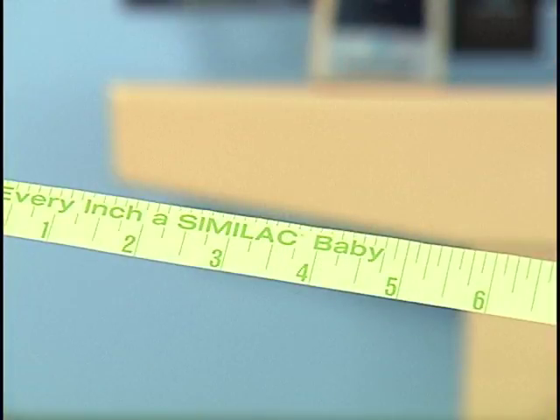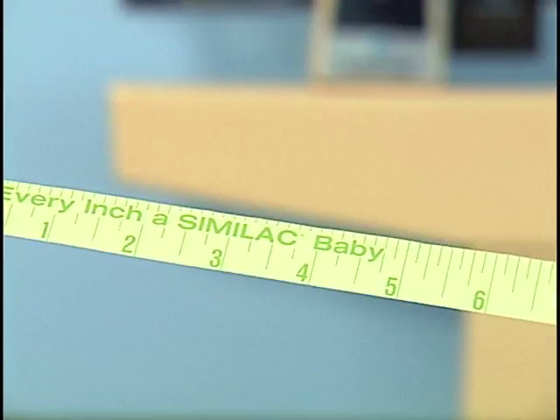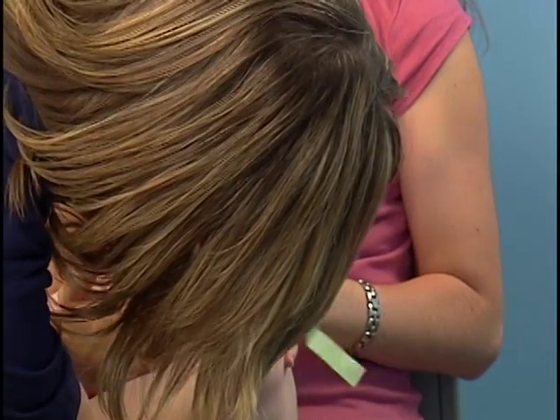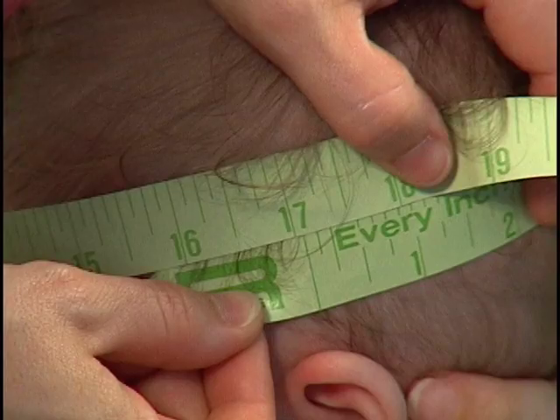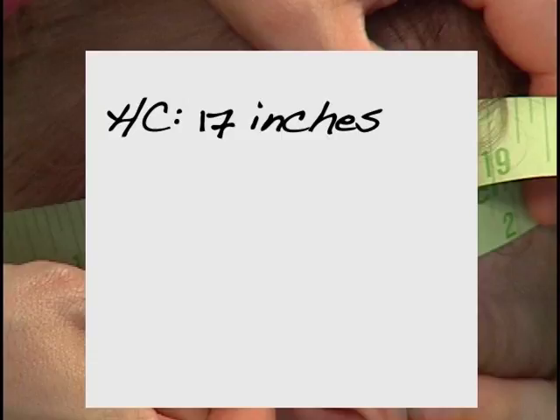Next, the medical assistant will show you how to measure head circumference in inches using a flexible tape measure. As you can see, one side of the tape measure is calibrated in inches, and the other side is calibrated in centimeters. Position the tape measure with the inch calibrations facing outward. Position the tape measure around the infant's head at the greatest circumference. Read the results on the tape measure to the nearest 1/4 of an inch. Be sure to read the results at the 0 mark on the measuring device, otherwise your measurement will be inaccurate. Jonathan's head circumference in inches is 17 inches. Jot down this value or make a mental note of it.